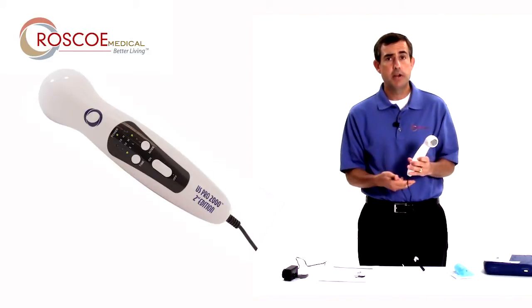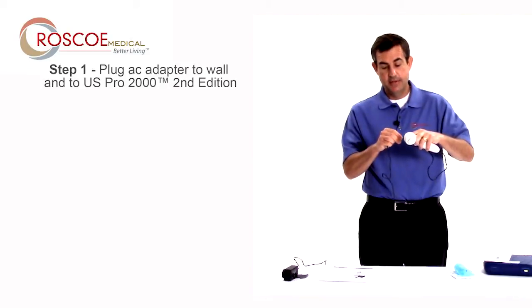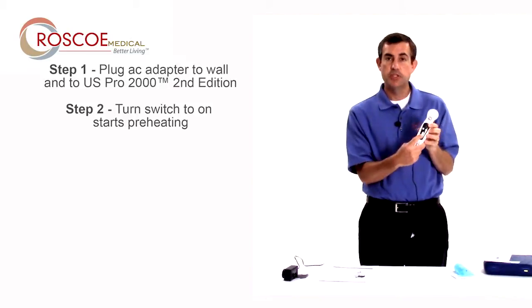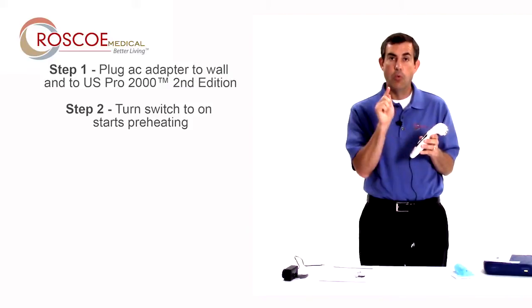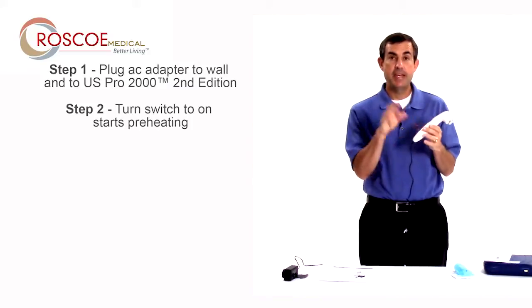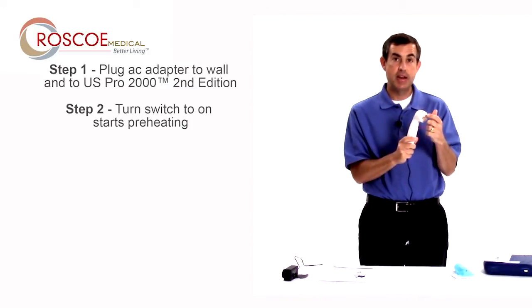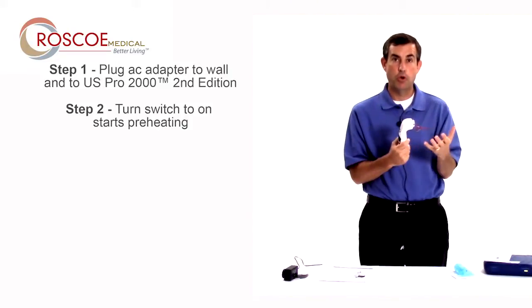So let's learn how to use it really quick. I plug the AC adapter into the wall and connect it to the US Pro. Once I connect it and turn the switch to on, you will notice that the lights begin to blink and rotate. What that is telling you is that the sound head is heating or preheating — that takes three minutes. That way when you begin your therapy the sound head won't feel cold to your patient.